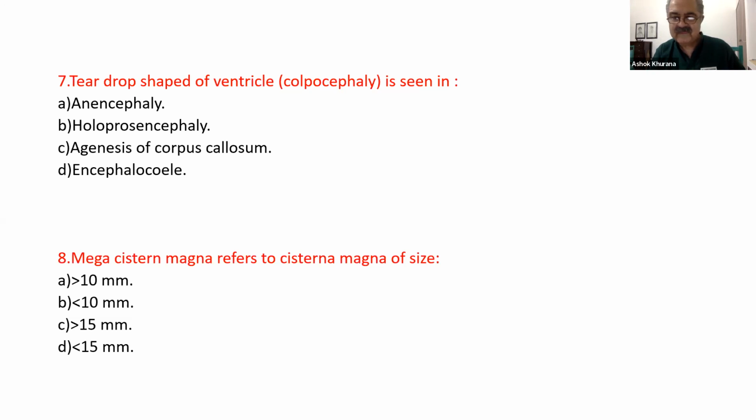Yeah. Thank you, sir. Number 8 is a very direct answer: anything above 10 millimeters, because 10 is the limit, anything above we classify as mega cisterna magna. Ashok, sir? The outcome of mega cisterna magna. Professor Khurana?